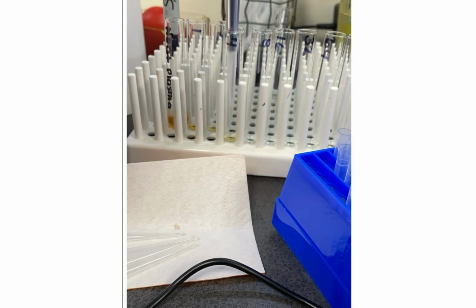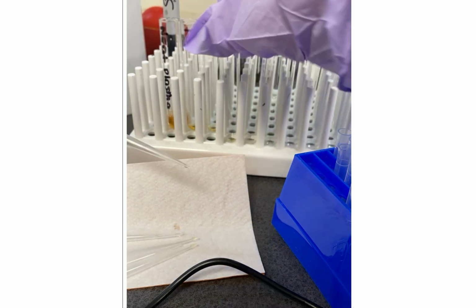I'll mix the content of tube number 4 using a brand new pipette tip, so I can get a homogeneous mixture. I'll then add this mixture to tube number 8. Again, tube number 8 has plasma of dilution 4 and 100 microliters of saline. I'll fast forward through the remaining tubes.